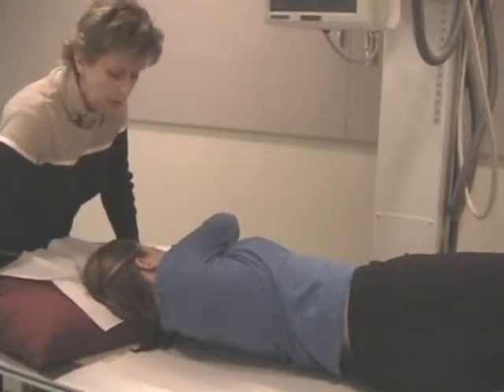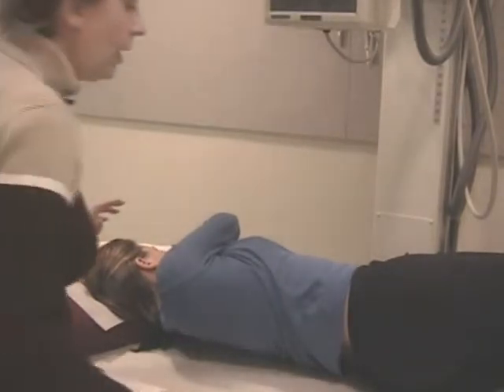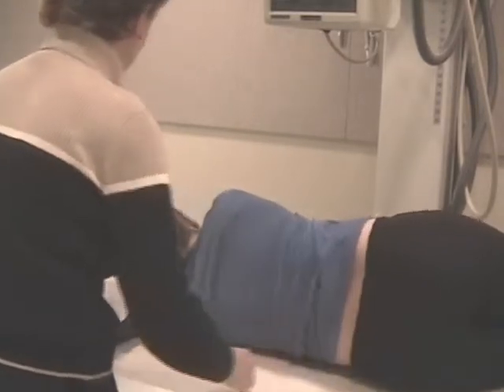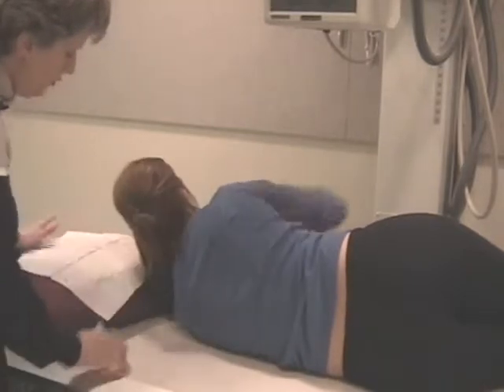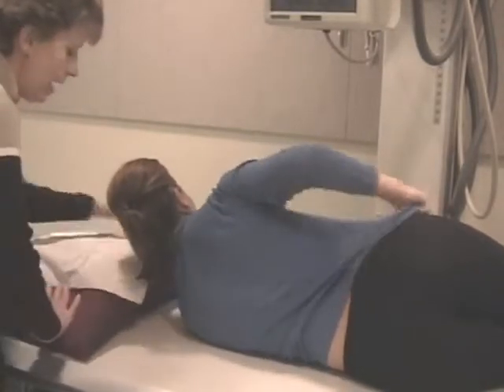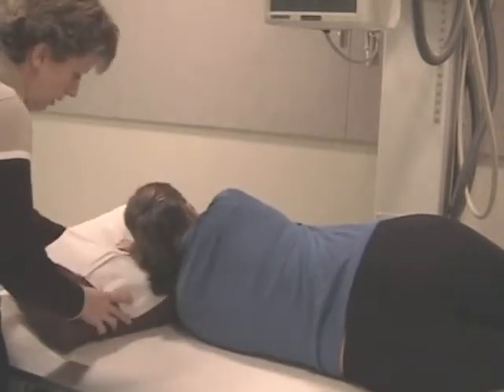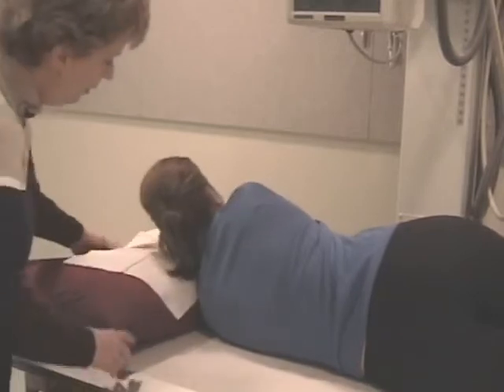Okay. So we've made our exposure, and now I'm going to have my patient turn way up onto her left side. Okay. I'm going to look at the pillow. I don't want her head dropping too much. You might want to double the pillow. Ask your patients how they're going to be more comfortable. Would you like the pillows a little tighter? You know, again, you might have to double the pillow.